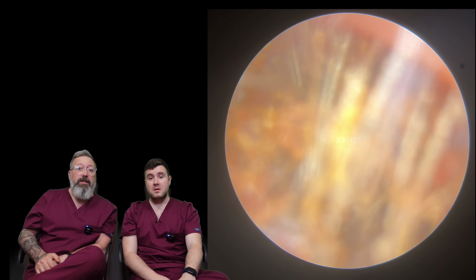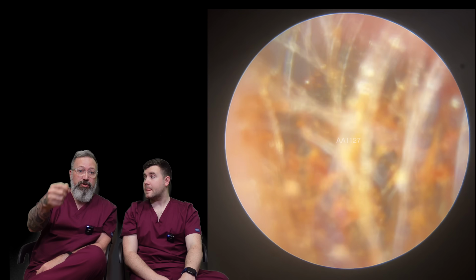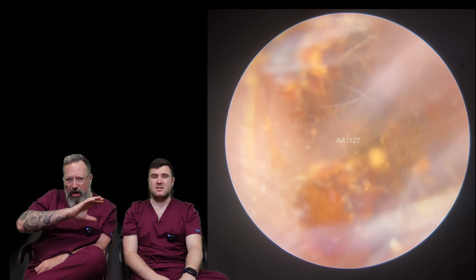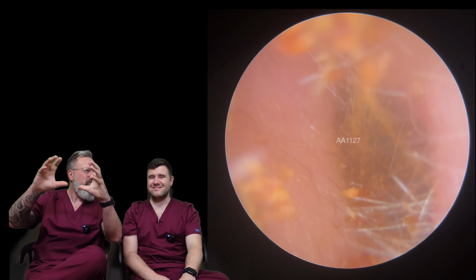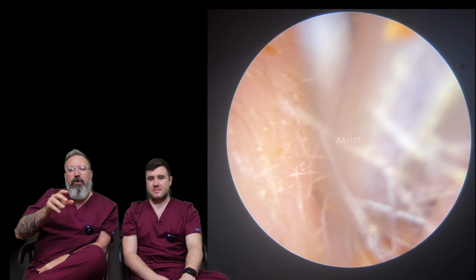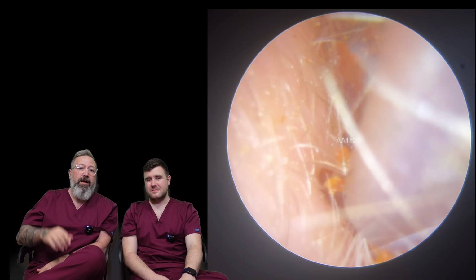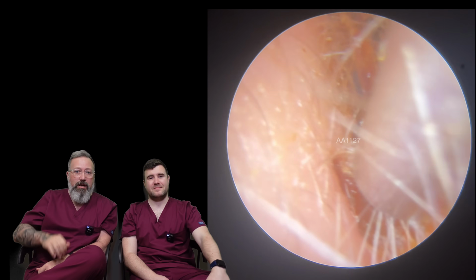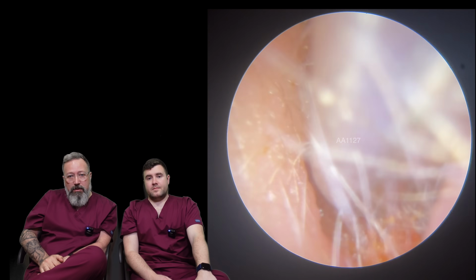Long one again, like mine, is it? It probably will be, actually, because it got to the point where I started to try and do one ear, and it was so solid. I got most of it out, but there was this last piece, always surrounded by dry skin, down close to the eardrum. So I put some oil in that one while I worked on the other one, then came back to it, and you could have just knocked on it. It was just that hard. Absolutely rock solid.